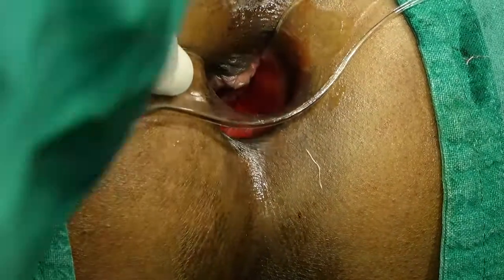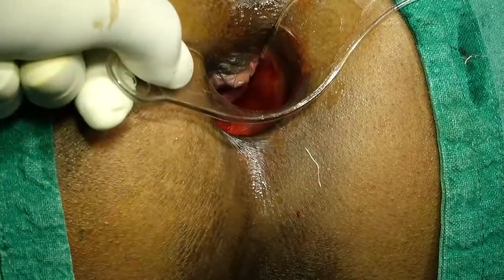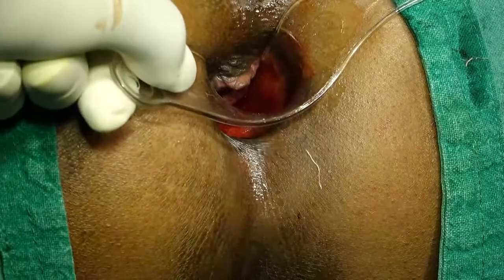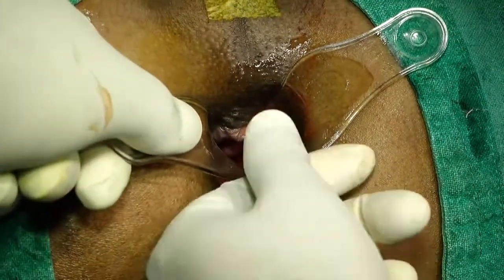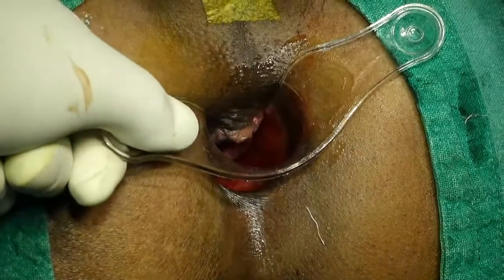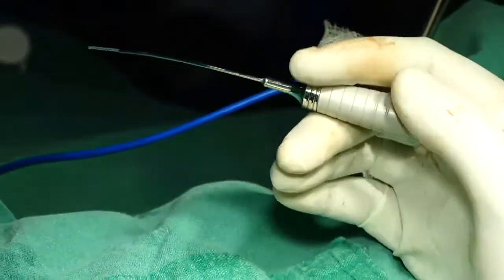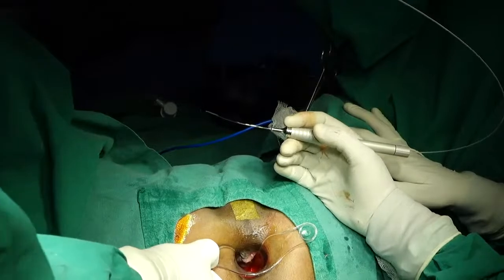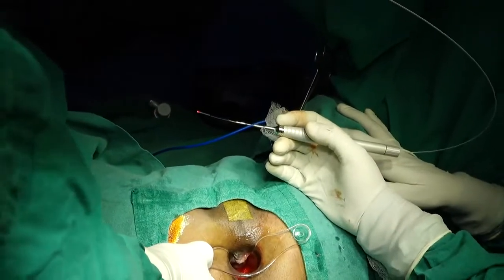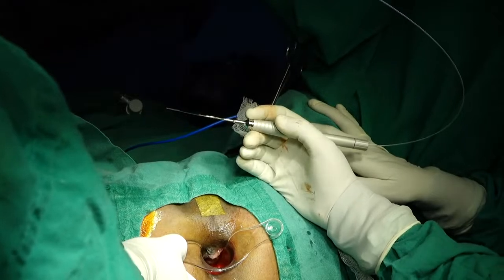Sir, after the HAL, Nigam sir, am I audible? Yes, sir. After this HAL, I am proceeding again for this laser hemorrhoidoplasty. So what is your plan, doctor? How much energy are you going to give each pile? Yeah, this is the formula for that. Grade 1, 150 joules, grade 2, 250, grade 3, 350, grade 4, 450 joules.